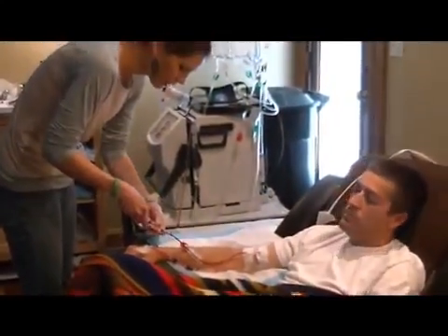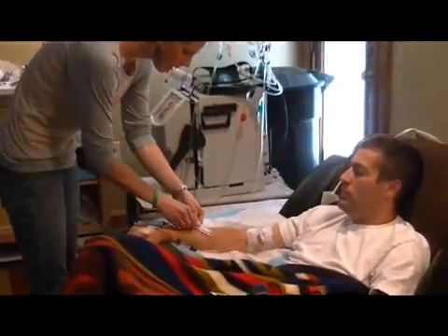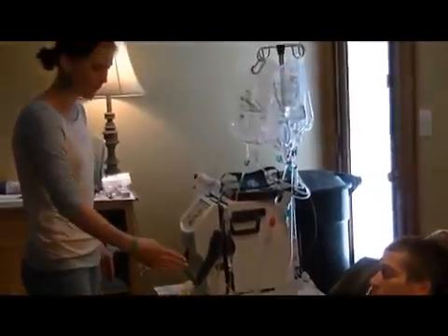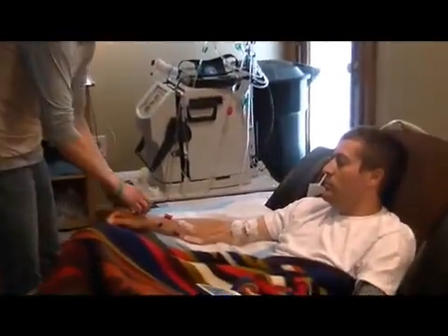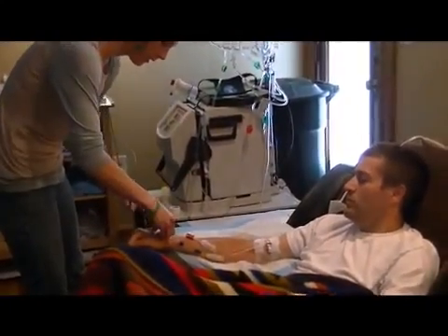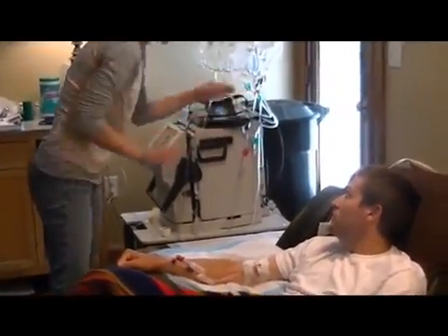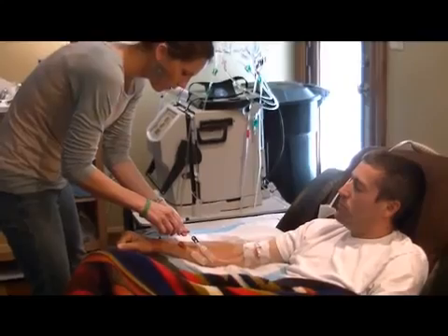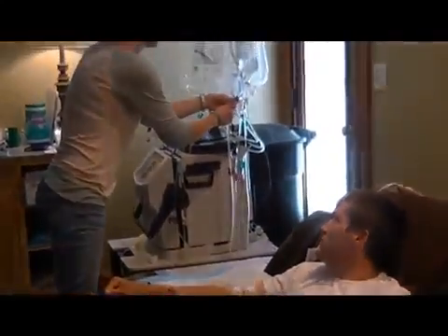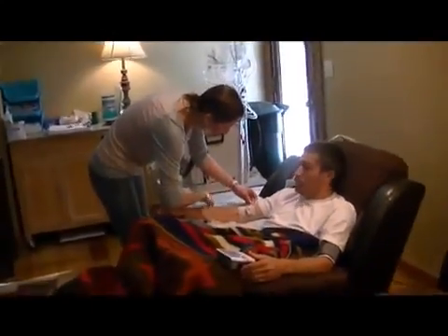We're going to go ahead and flush the arterial line with saline so that blood goes back into his body. And then you don't have to flush the other one, because the saline that's rinsing back now actually puts it all back in. And remove the tape. And the rinse back is done. So we'll undo blue, and you hook back up here, and then the machine will be ready to tear down. And now we'll remove the tape from the top one first.